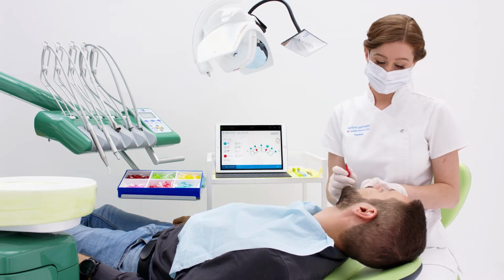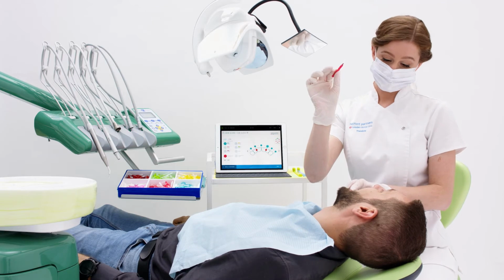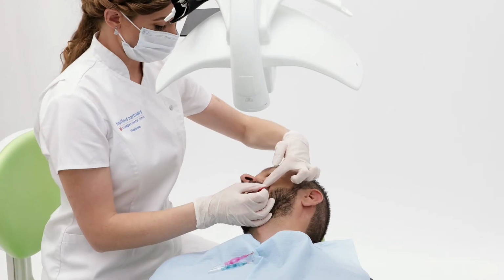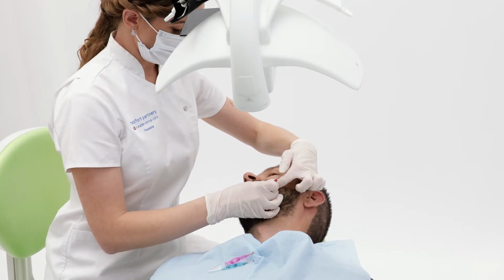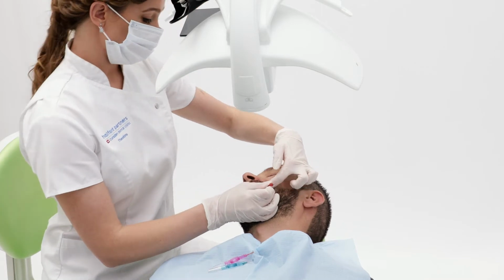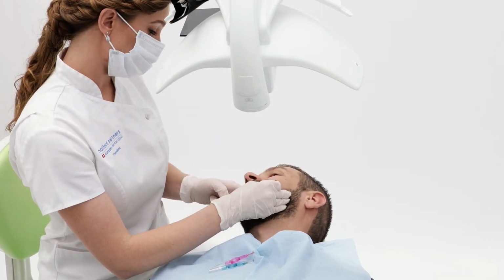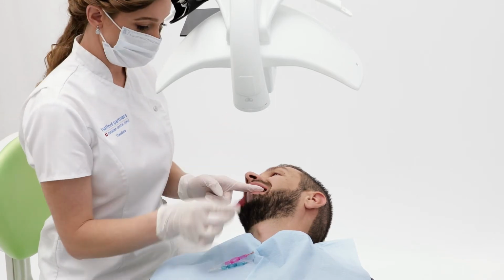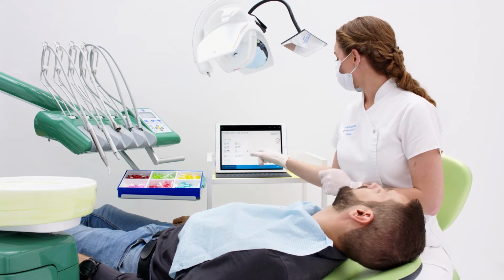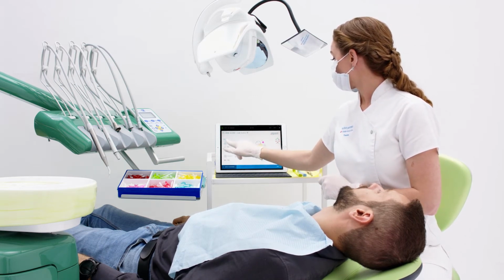Moving on to the upper left sextant, I demonstrate also the technique needed for the red Perio 405 brush. I demonstrate this to him and once again input into his score the brush colours and any areas showing inflammation.